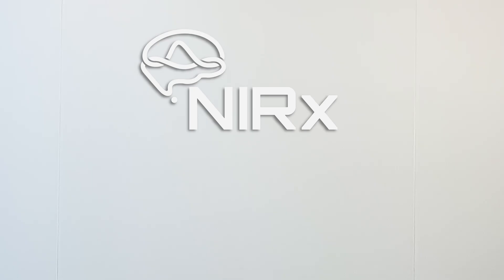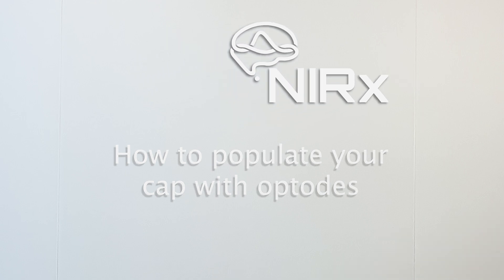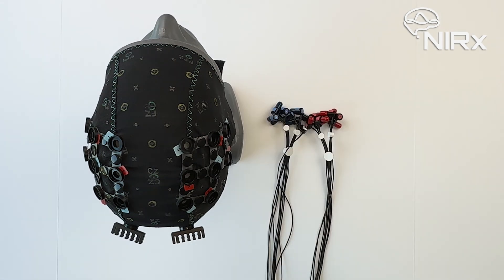Hello, and welcome to a hands-on comprehensive guide by Nirex on how to populate your cap with optodes. To follow along with this guide, you will need a cap with a montage made that fits your participant, the optode bundles, spring tops, a green velcro strap, and potentially some black cable ties.